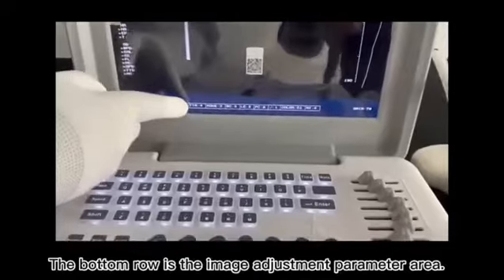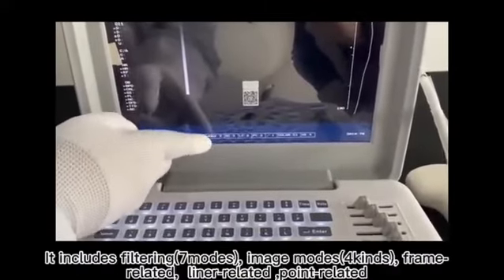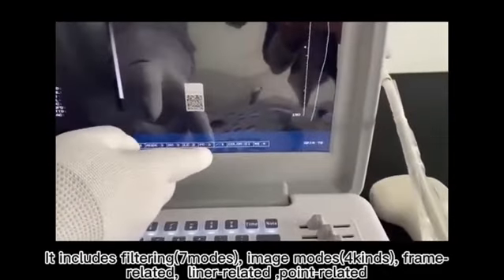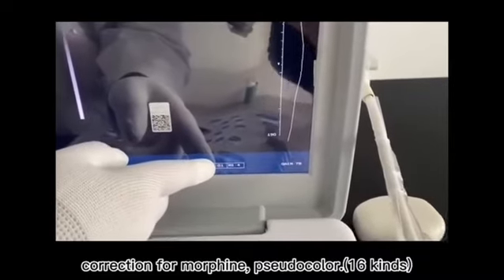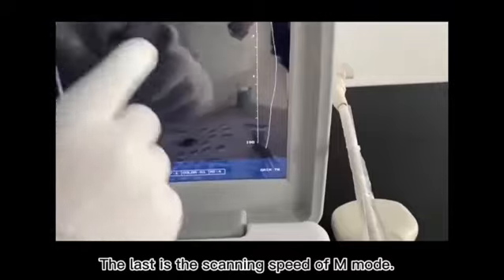The bottom row is the image adjustment parameter area. It includes filtering image modes, frame-related, linear-related, point-related, correction for morphing, pseudocolor. The last is the scanning speed of M mode.